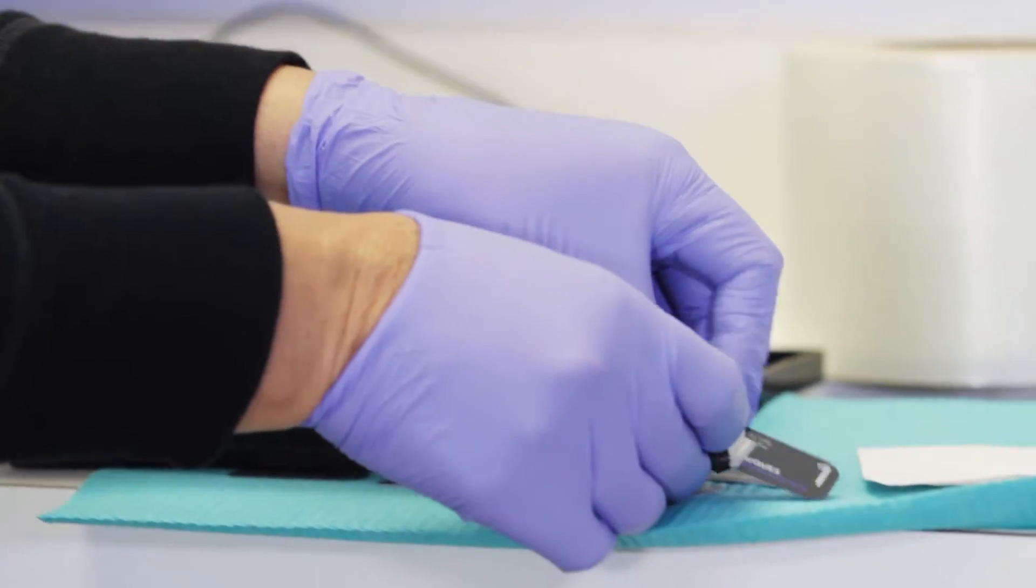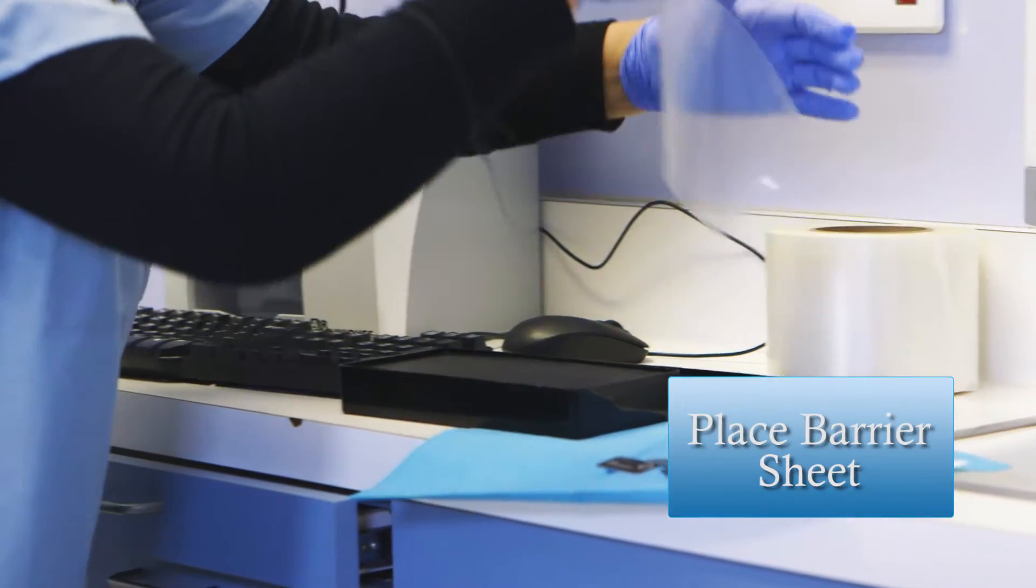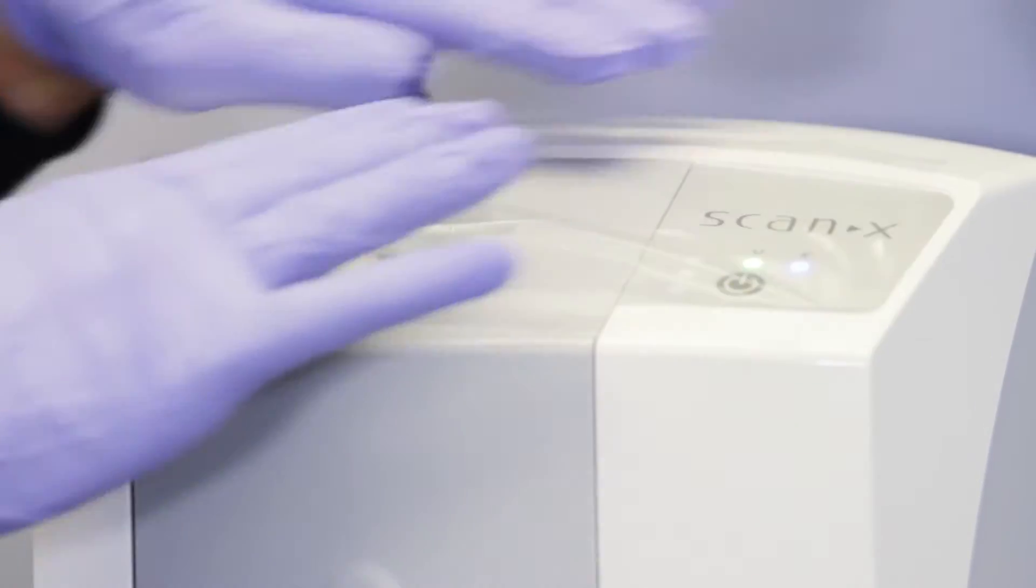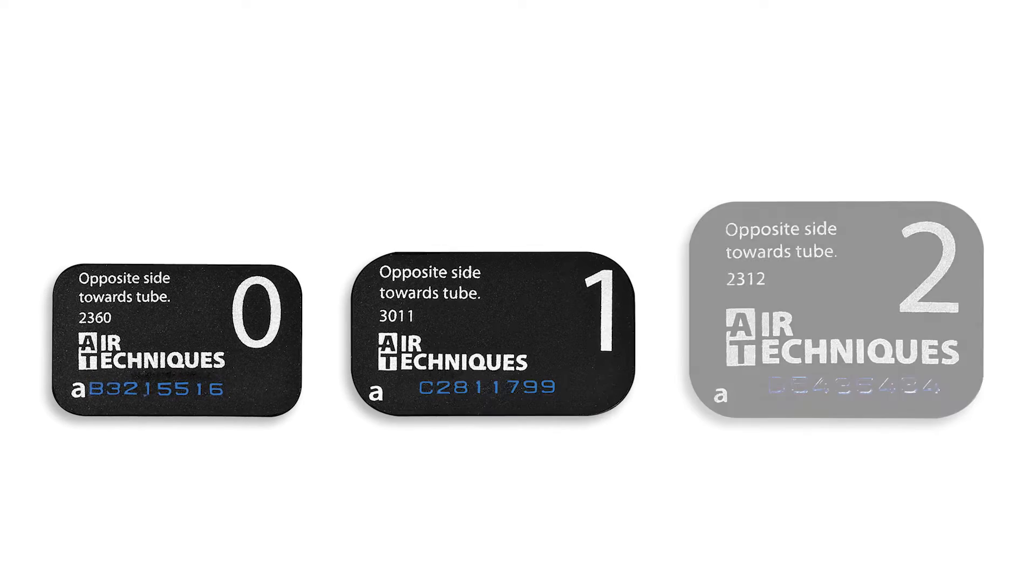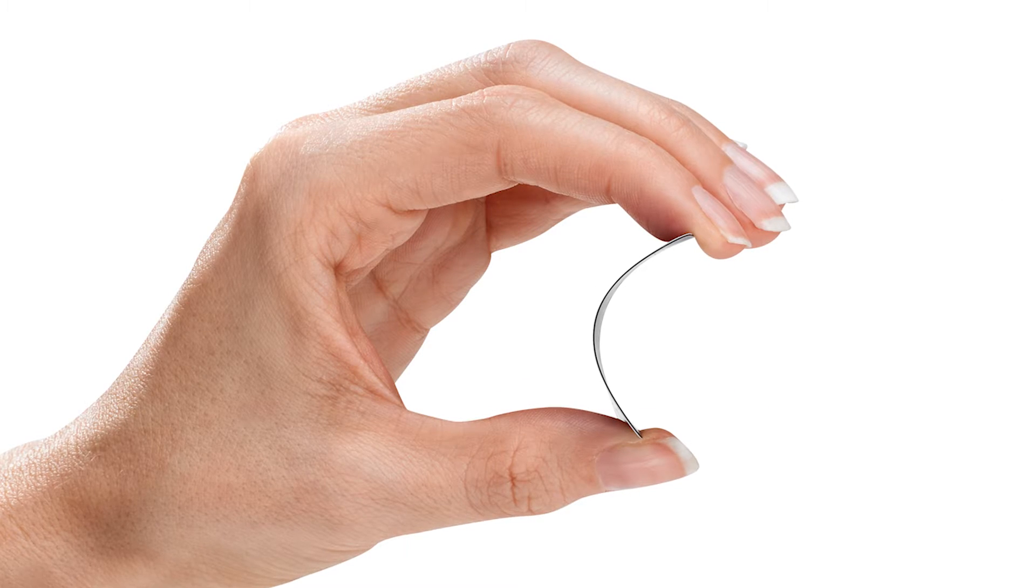After prepping your phosphor sensors, place the barrier sheet over the Scanex Swift insert. Sizes 0, 1, and 2 of the Scanex Phosphor sensor are interchangeable.